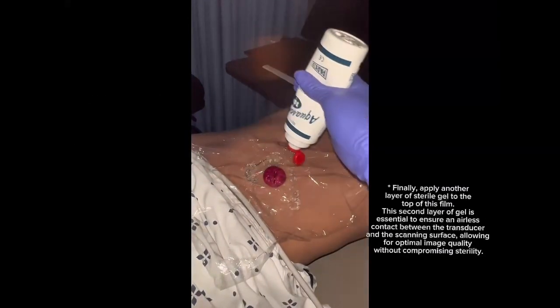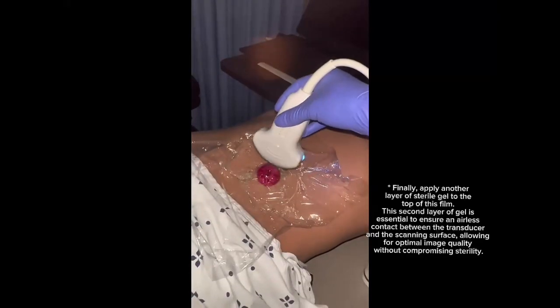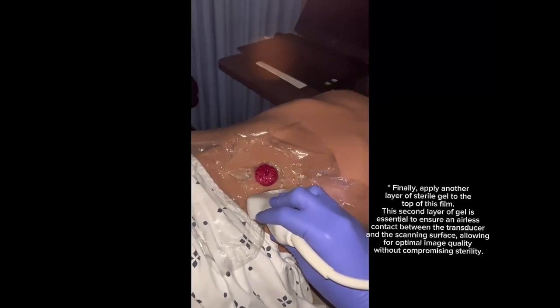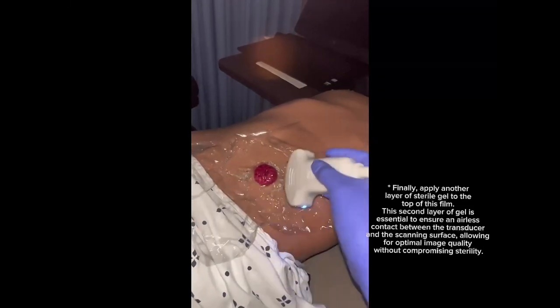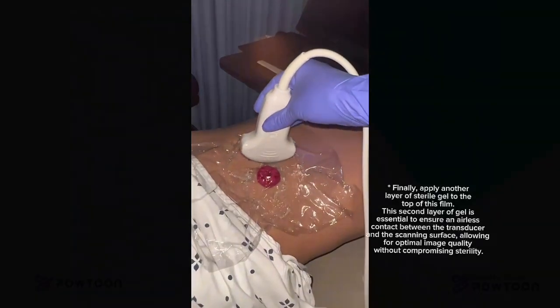Finally, apply another layer of sterile gel to the top of this film. The second layer of gel is essential to ensure an airless contact between the transducer and the scanning surface, allowing for optimal image quality without compromising sterility.